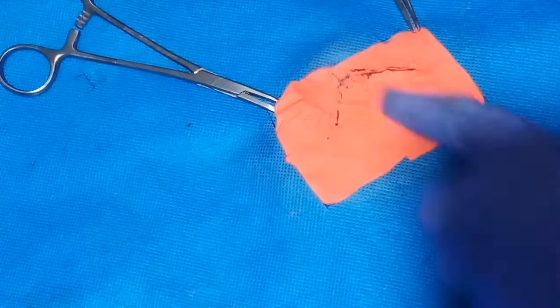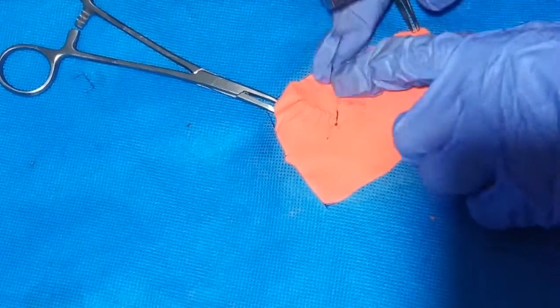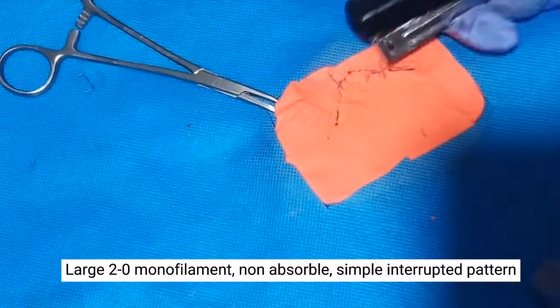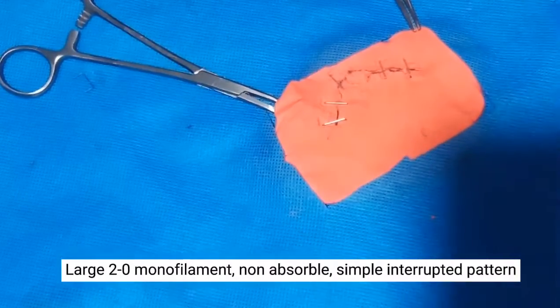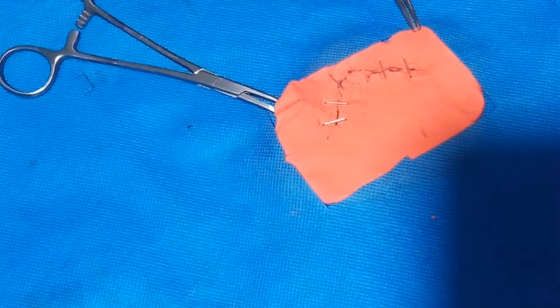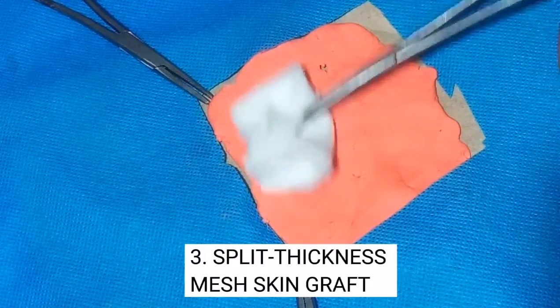Here we are locking the flap using surgical staples, though a large 2-0 monofilament non-absorbable suture material will be helpful to tack, especially in the skin of the limbs up to the thoracic wall. Next, we have the mesh skin graft.